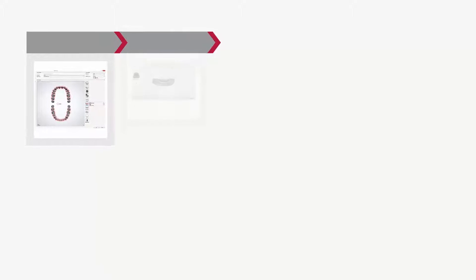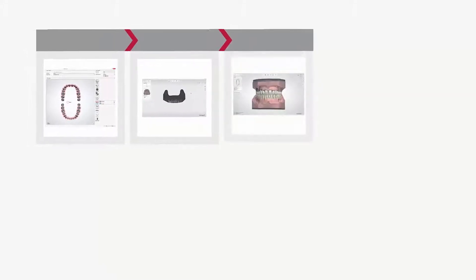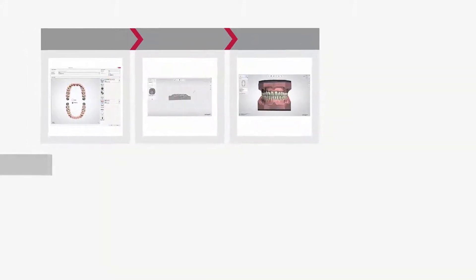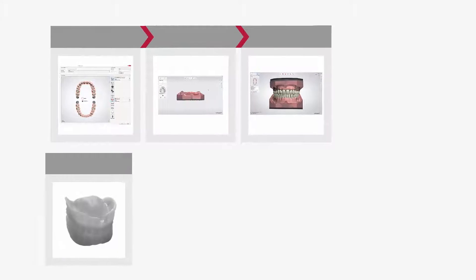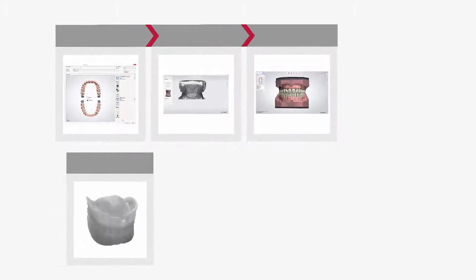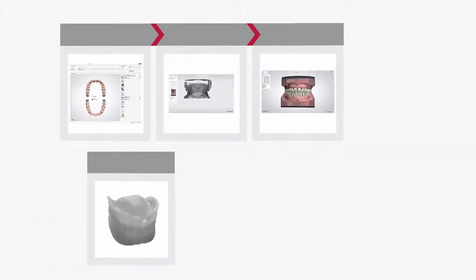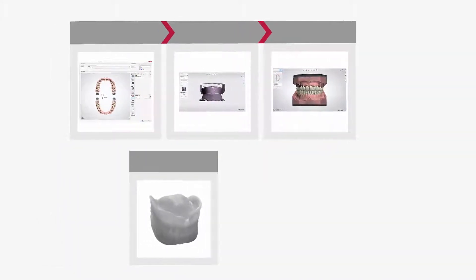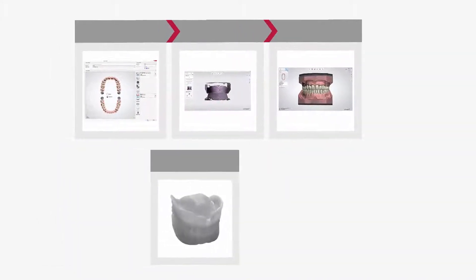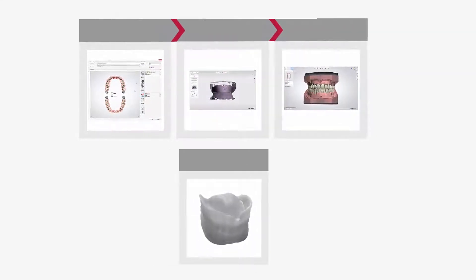Start the case as usual by creating the order. Scan the models and design the denture. The try-in denture design is manufactured using either printing or milling. When you have the try-in denture ready, send it to the dentist to check in the patient's mouth.